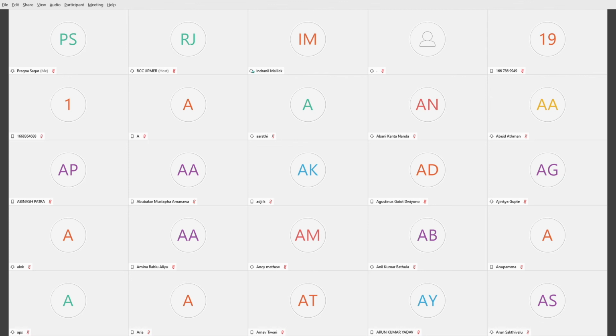Okay, so 66 gray. Why not 60 gray in 20 fractions? When these nodes are far away from the bowel, we sometimes go up to 60 gray in 20 fractions. But when they're close to the bowel, we treat to 54 gray in 20 fractions. That is just our practice. It is not based on any evidence.